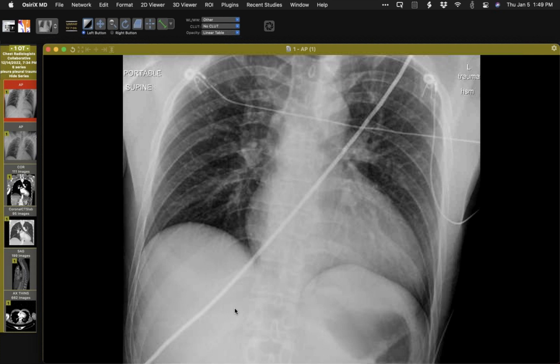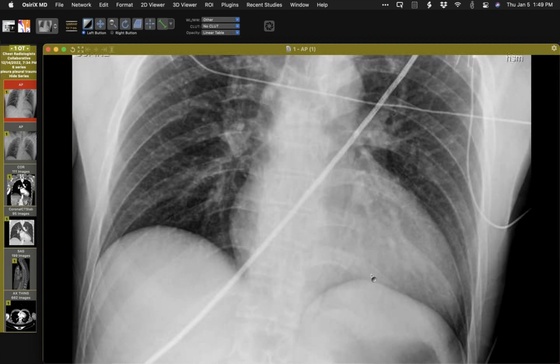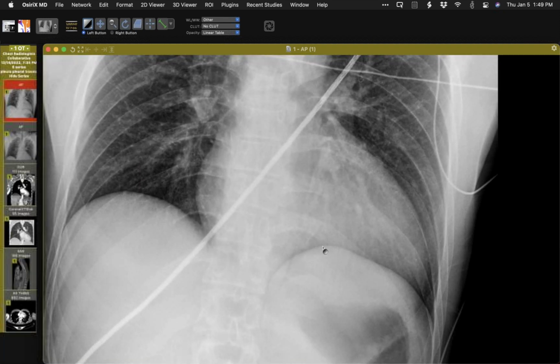So the other two things that are present here, the first is that in addition to the slightly deep sulcus here, the interface between the left hemidiaphragm and adjacent lung or air is very sharp. And if it's very, very sharp, you should think that it may be contacting air. And then the other place to look is right here. It is very, very unusual. Normally one doesn't see this. If you see this portion of the hemidiaphragm as a very sharp interface between it and air, unlike what we usually see, which is here, then you should again think of this portion of the diaphragm contacting pleural space air.